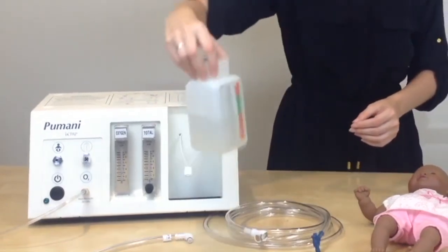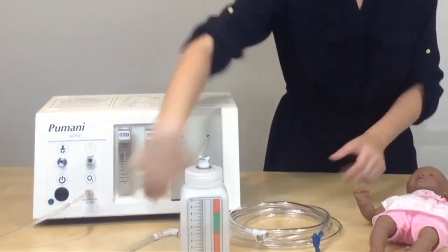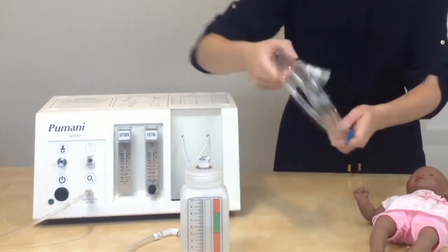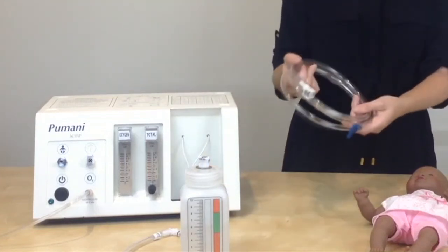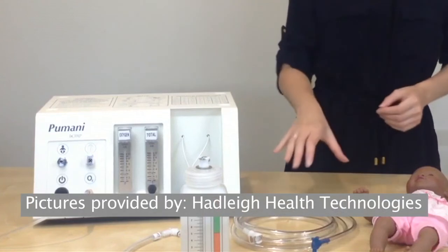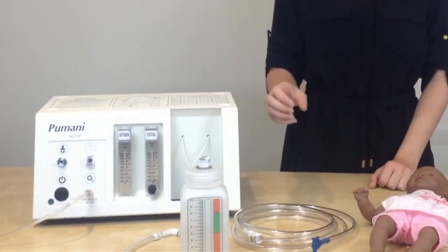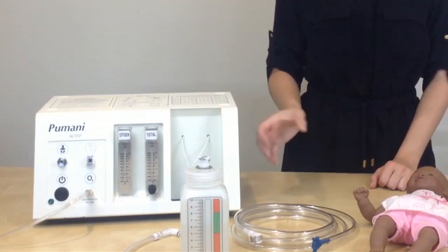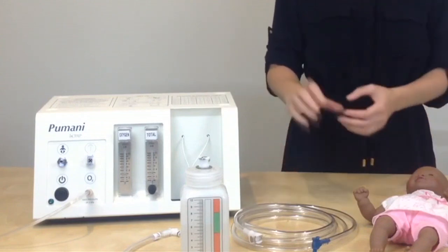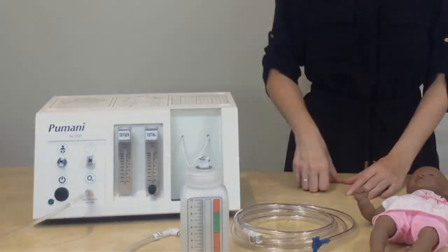You can clean and reuse the bottle and clean and reuse the bottle tubing. The patient tubing is also labeled as single use only; however, you may choose to clean and reuse this as well. Any of the components that you are going to clean and reuse, you can soak in a 0.5% bleach solution for 10 minutes, rinse in clean water, and then lay out and dry the components before placing on another patient.